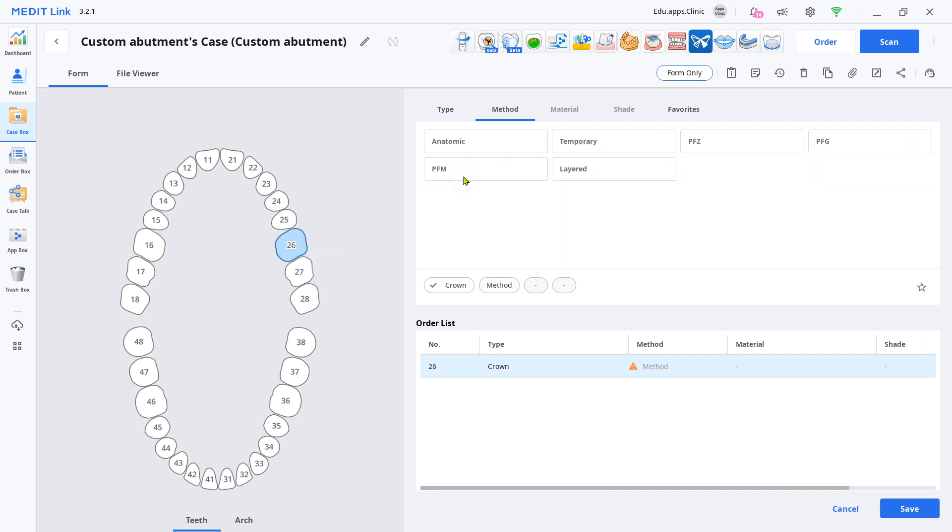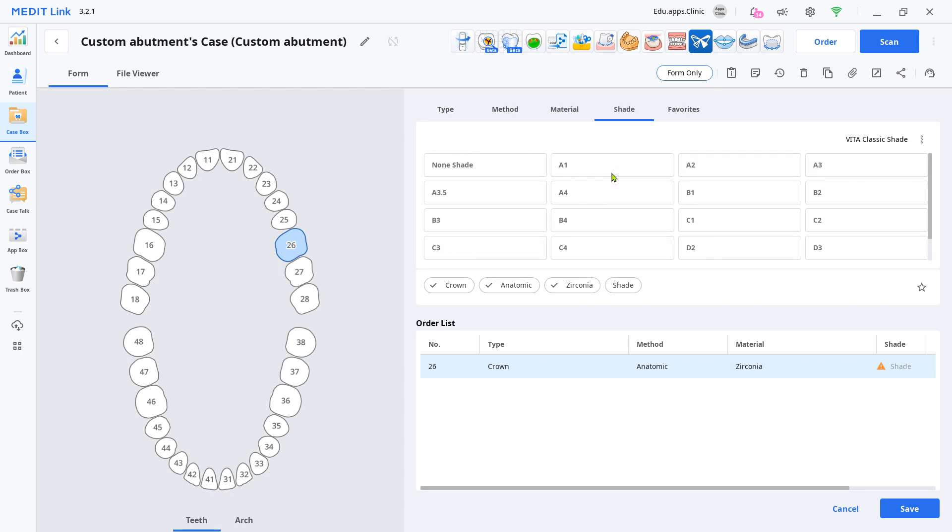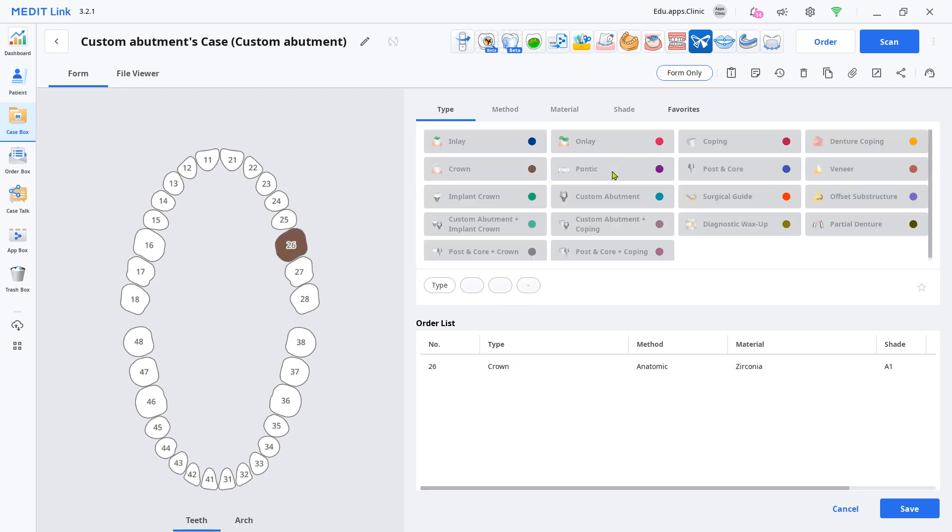Anatomic, your desired material and shade. Have your scanner ready and click Scan.